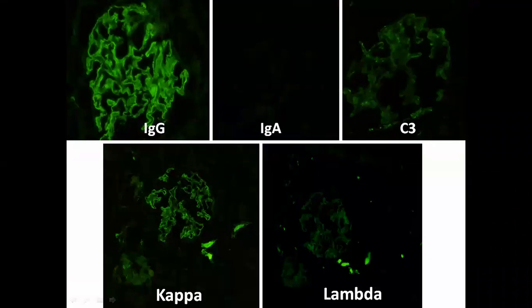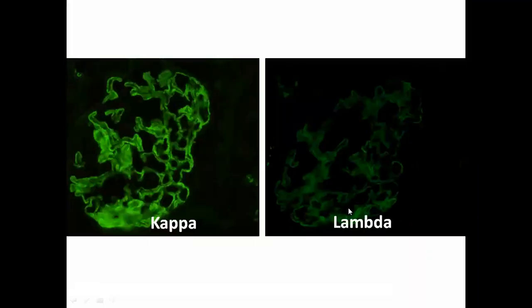We did immunofluorescence. Immunofluorescence shows IgG, IgA negative, C3 trace. Kappa is like 2 plus, and lambda was less or possibly negative. So this is just a comparison for kappa and lambda. Kappa is there, but lambda is negative. This is unusual, because if you see light chain restriction, then you have to think whether I'm dealing with a dysproteinemic state or something of that sort.